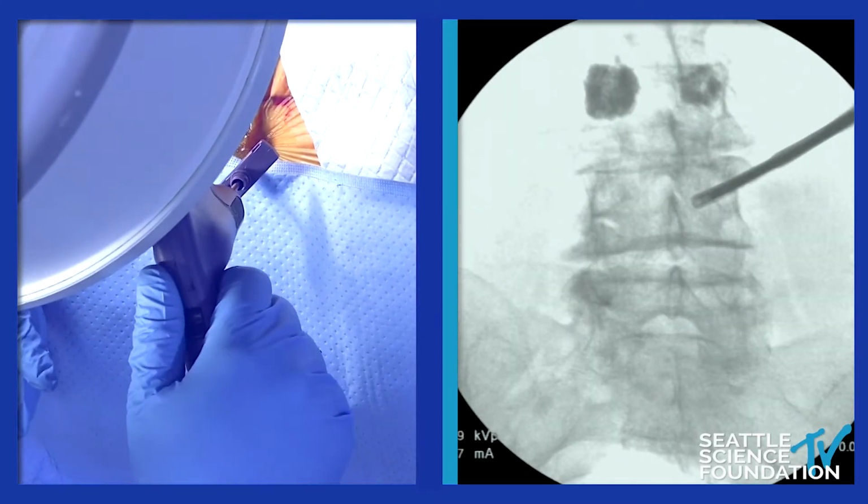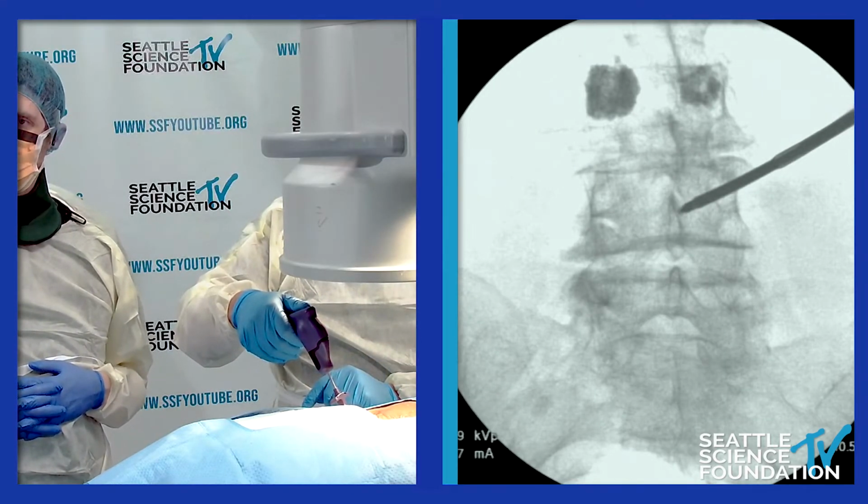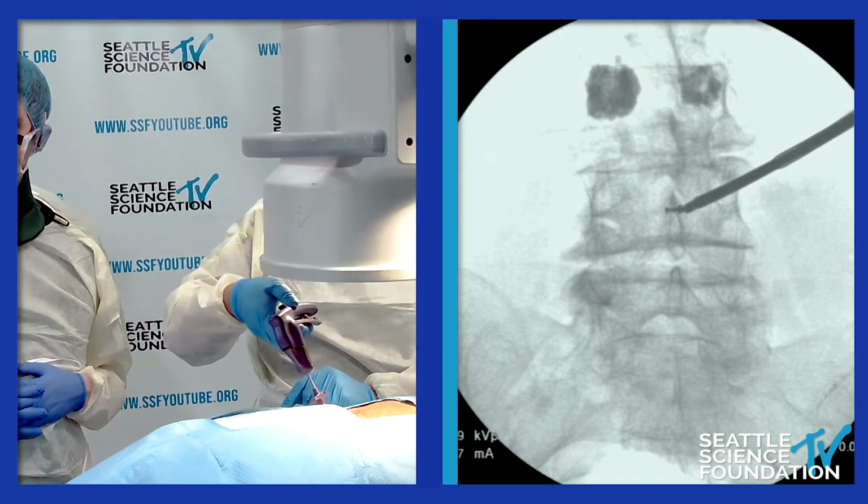So a lot of times in a regular kyphoplasty rod, I'll use this to help get across. In a particular fashion.